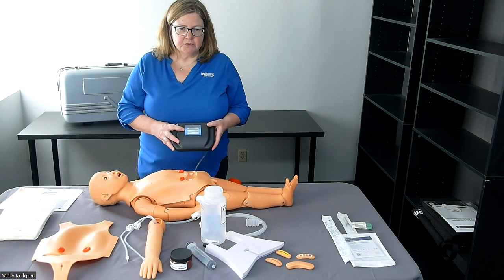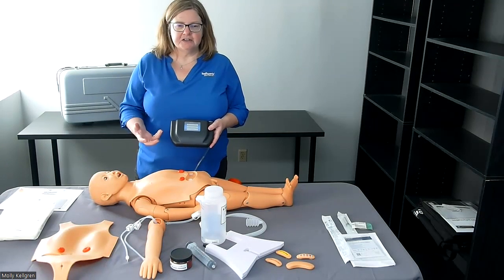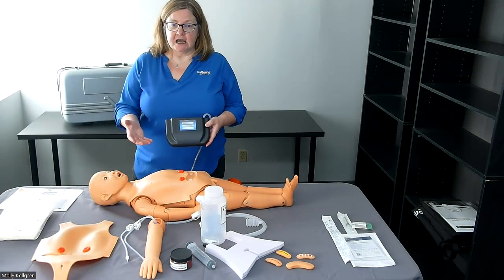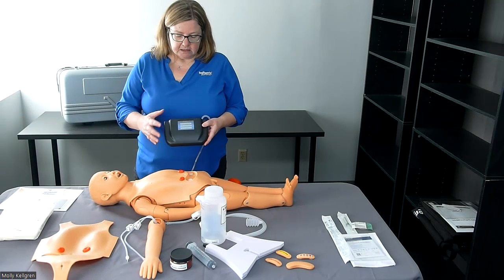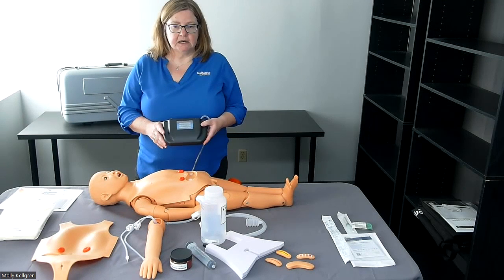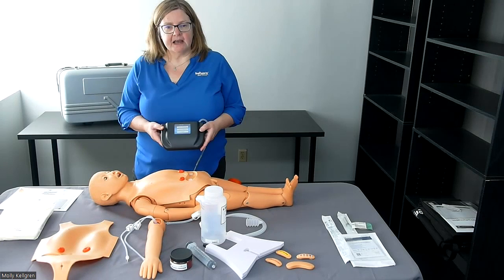Another option is using the simulator in test mode. The test mode gives a student a countdown to begin compressions, then they perform compressions while a timer runs. When the timer runs out, they stop and are given feedback about the rate and depth of their compressions during that test period. The third option on the screen is language — you can switch between English and Spanish. All of the programming, rates and depths are completely in line with the current American Heart Association CPR guidelines.